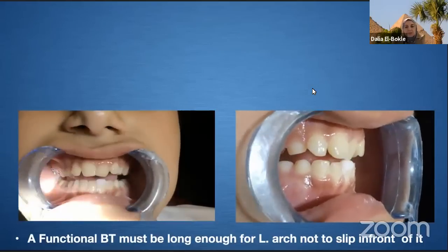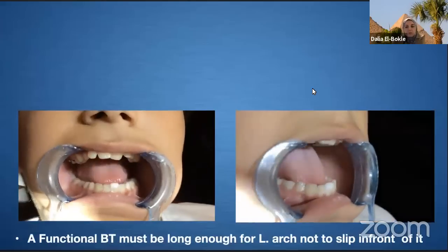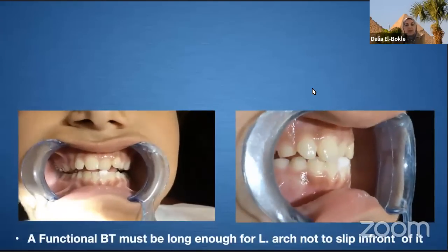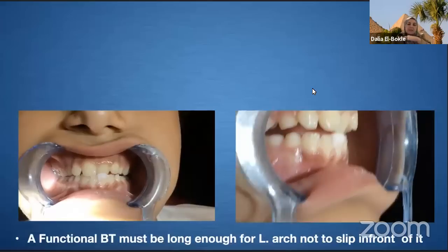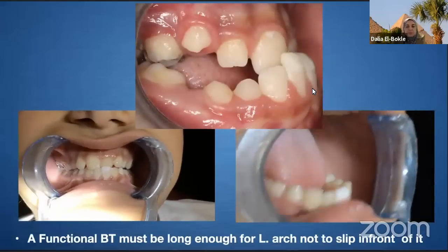So you can see here on the side view how the patient is able to protrude. In this case, you need to make it longer, extended more to the lingual in order to avoid this problem.